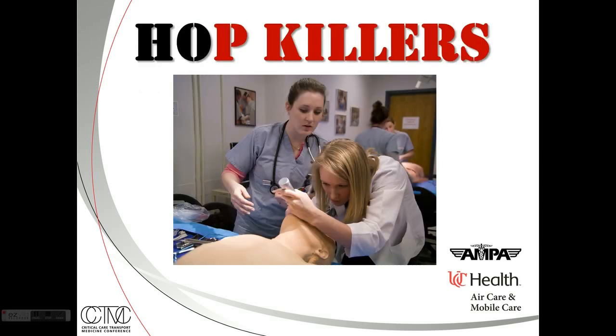This is not the sort of case to have the medical student get a try at the intubation. That's just not fair to the patient. I love medical students, but a case like this, where the patient's very life is on the line, and they're starting from 6.85, we need to have the most experienced operator do this intubation and get it very quickly.